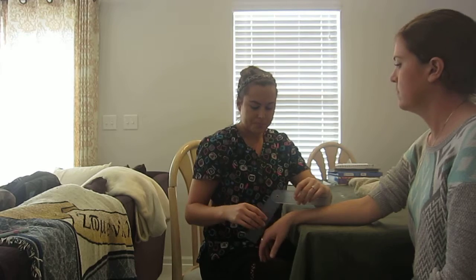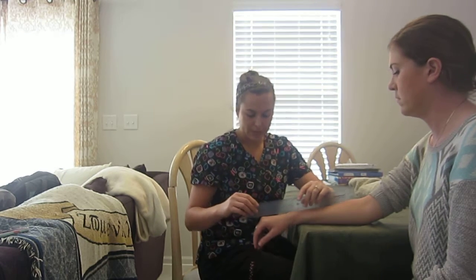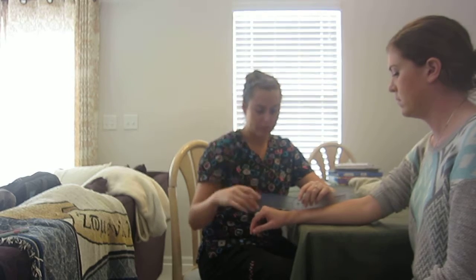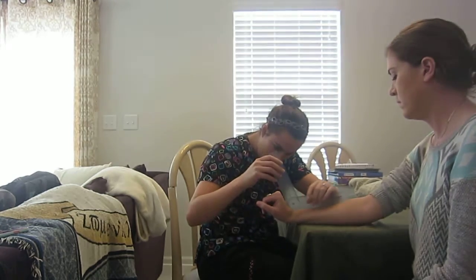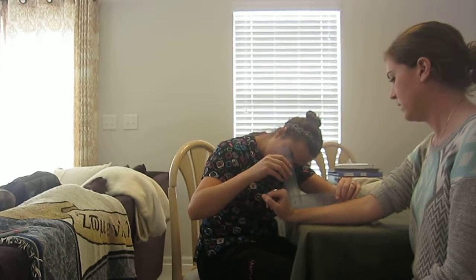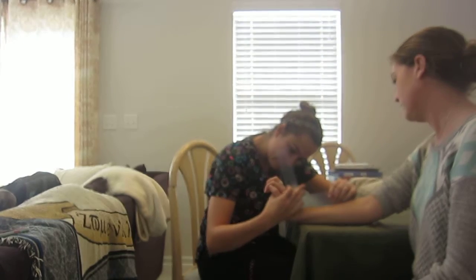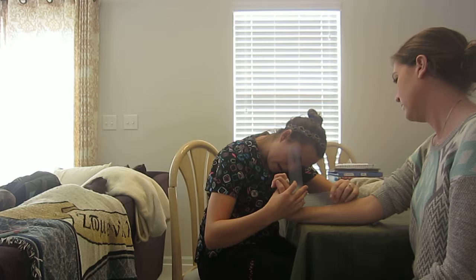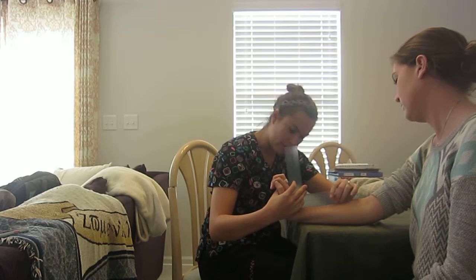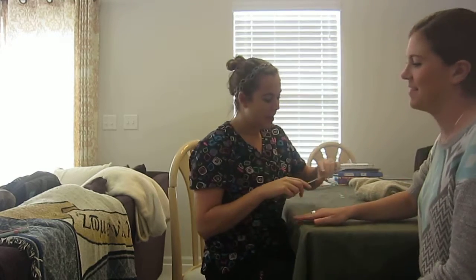So that's good. I'm going to be using the same landmarks, and now I want you to bend your wrist back towards you for wrist extension. And here I'm getting 84. Okay. And let me just do this passively. And you are right at 90 degrees. And the norm for this is 70, so you got some good motion there, mobility.